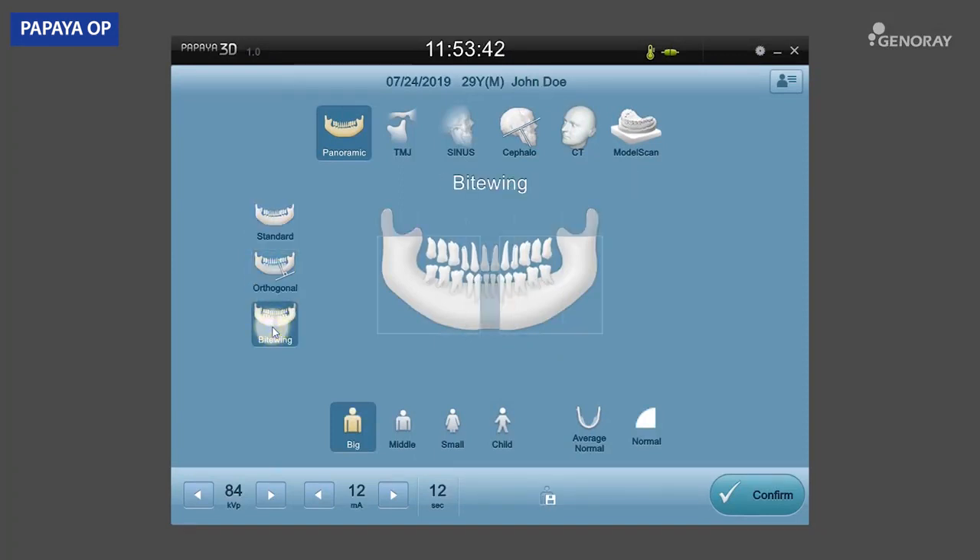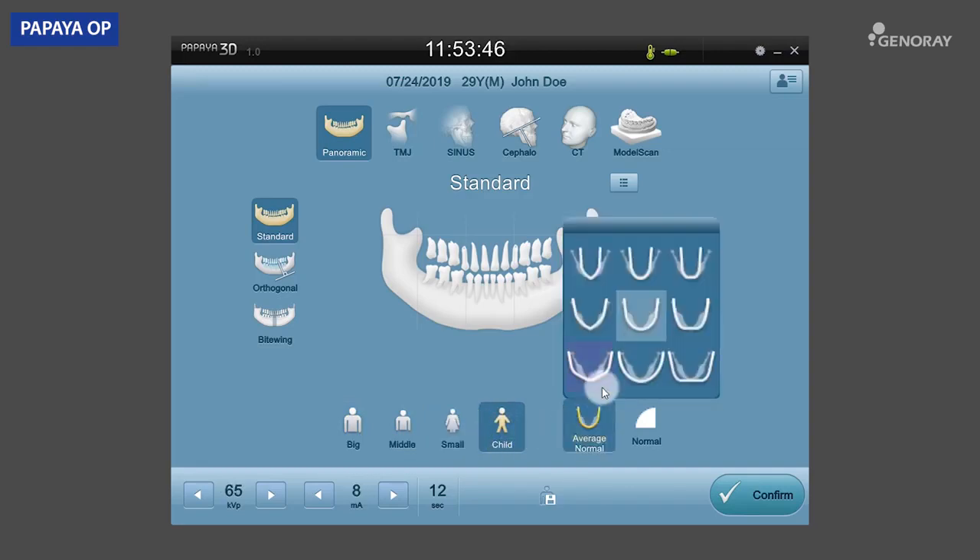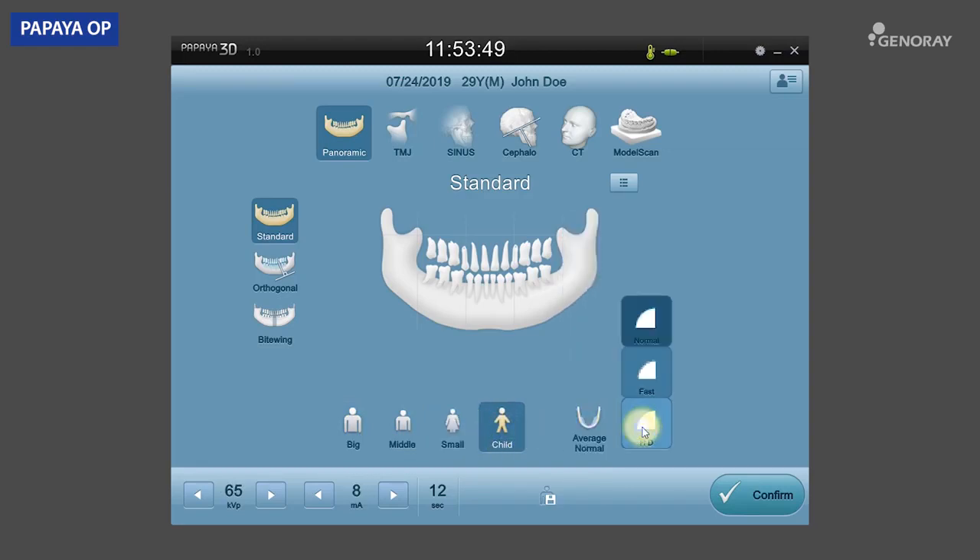After selecting the exposure mode in the OP window, select the patient size, shape of arch, and image quality.